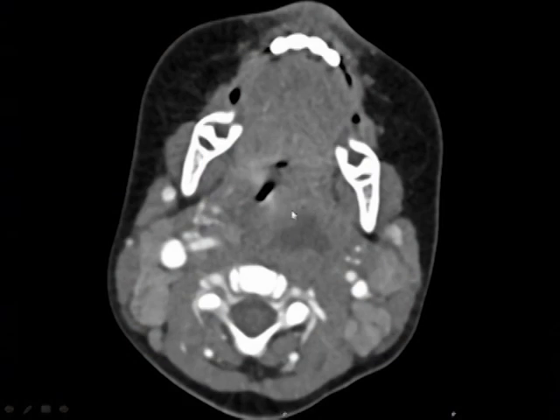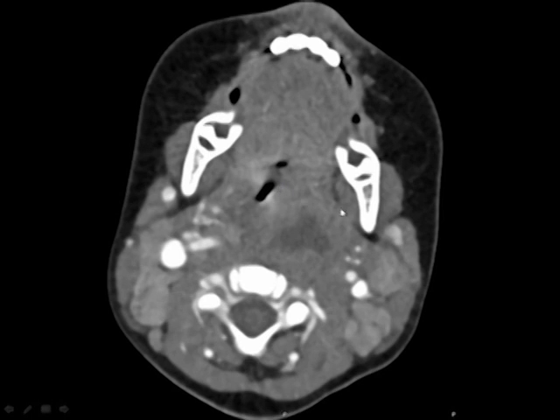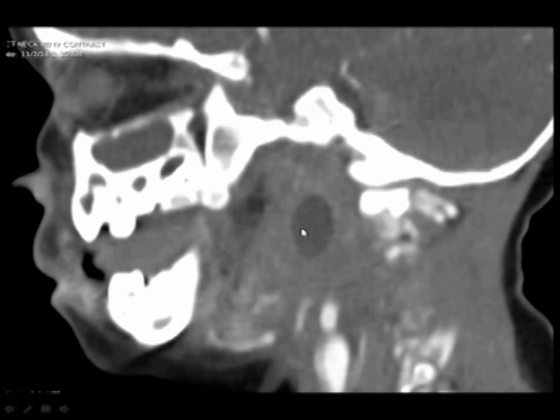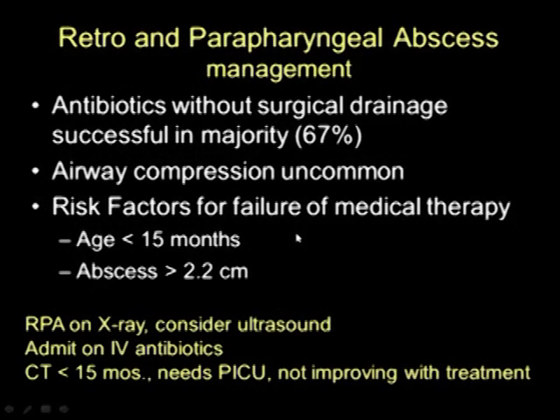There's an abscess there, but we got a CT scan in this case, and you can see there's an abscess in the retropharyngeal space. It's causing the airway to buckle a little bit to the right. Remember, buckling of the airway or movement of the airway to the right can occur from a mass lesion — it can also occur from expiration. This is just another CT reconstructive view, and you can see there's a big fluid collection.